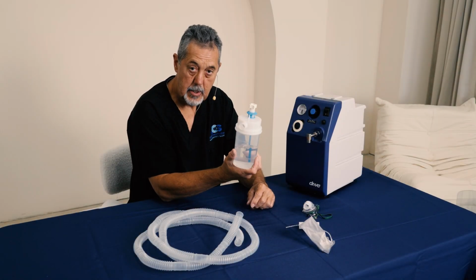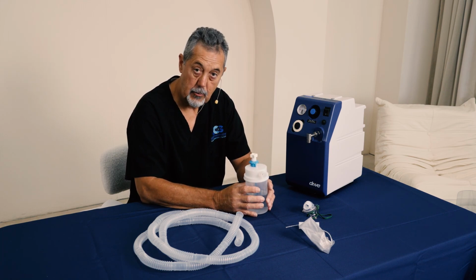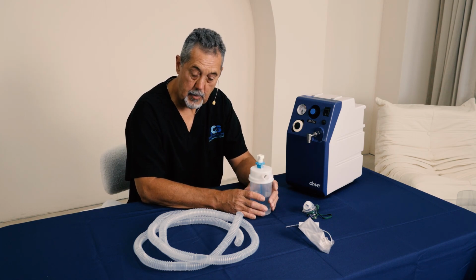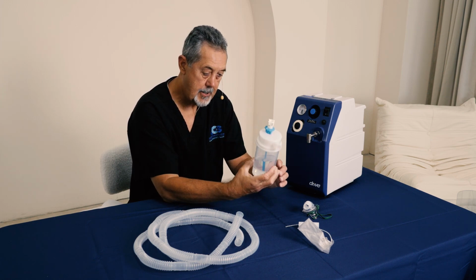On the large volume nebulizer, if the insurance company sends you 2 of these per month, then change it out every 2 weeks. If they do not, let's say you only get 1 per month, then you're going to want to do a maintenance, a disinfection and cleaning on this on a weekly basis.